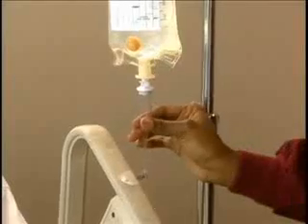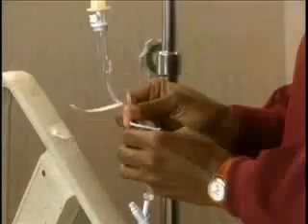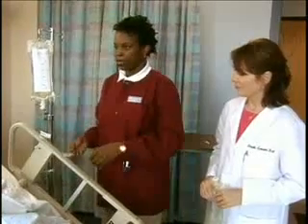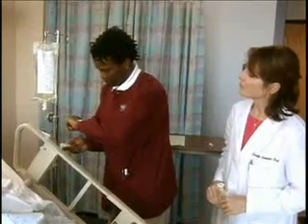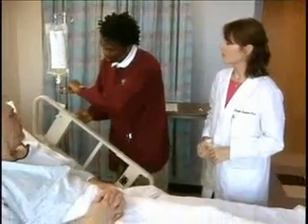Oh, the drip chamber isn't half full. Just squeeze until it's half filled, Tamika. Okay. There you go. All right. Now I unclamp and adjust the infusion rate as ordered, which is 14 drops per minute or 80 cc's per hour.